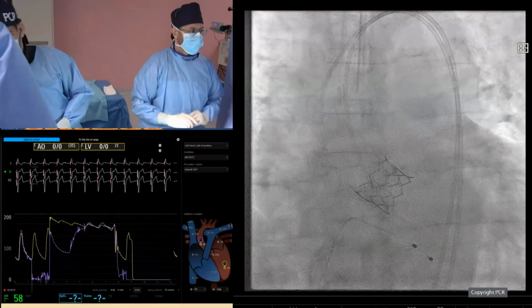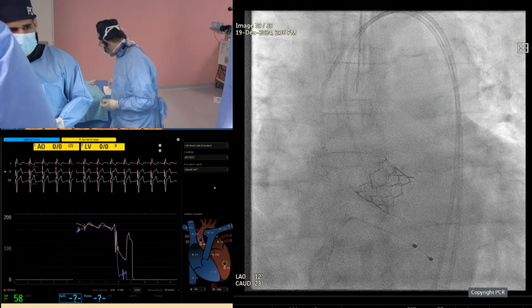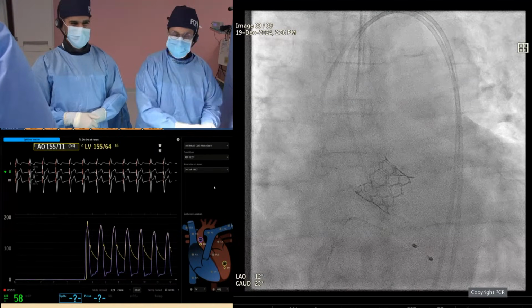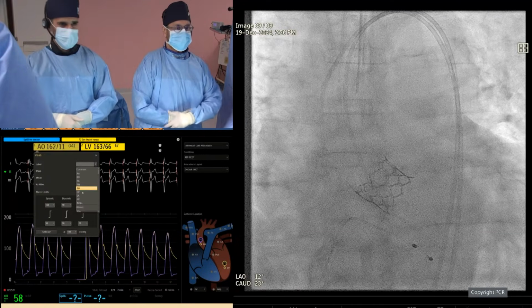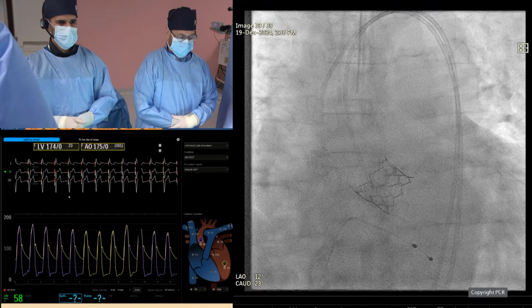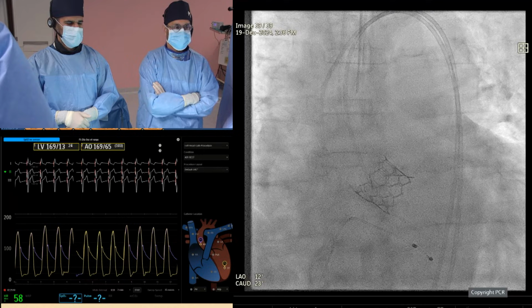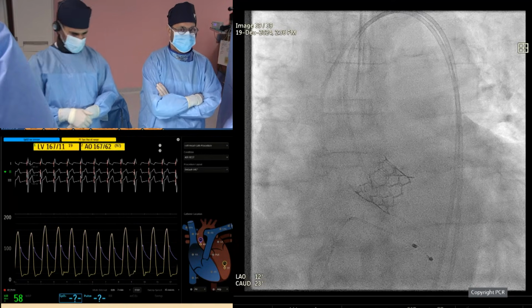Yes, we use it very commonly because sometimes the anatomy will force you to go to this one, and sometimes you choose it by default or by selection because you need the most accurate point to position your valve, which is reproducible, either the coplanar or the cusp overlap, which works with both self-expandable and balloon expandable at the same time. What about using a hybrid, like a blend of both? Yeah, we use it commonly.